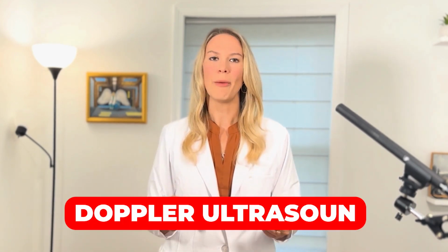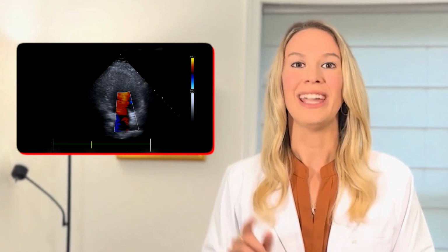And so with Doppler, we can see how that blood is flowing. It's like watching water move through the pipes. The colors, and you can pick any colors you want, but we typically use red and blue, just tell us the direction of the blood flow in comparison to the ultrasound probe. So blood moving either towards or away from the ultrasound probe. If the flow is smooth, that's what we want to see. Now, if you see turbulent blood flow or you see color going in the wrong direction, then it might be a problem.